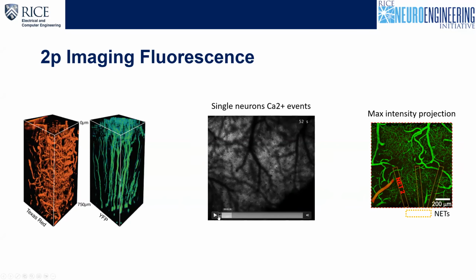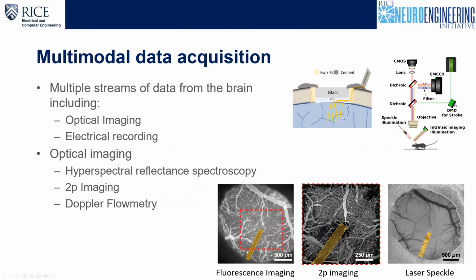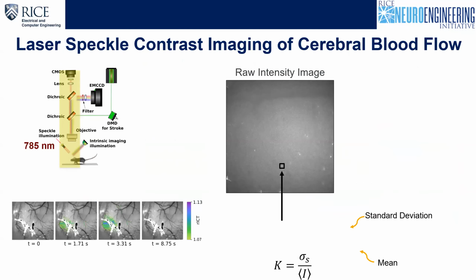And here, on the right is a maximum intensity projection. It's a standard way to process this image. You can see these big vessels are on the surface, and all of these small vessels are going deeper. So this is a top-down view of the brain, and you're seeing very deep levels as well, all of the small micro vessels which are penetrating into the tissue. All of these yellow dots are the electrodes, the electrical devices that I showed you. There are three of them highlighted here. As I mentioned earlier, we have these four shanks going inside the brain, so that we can measure from different spatial locations.